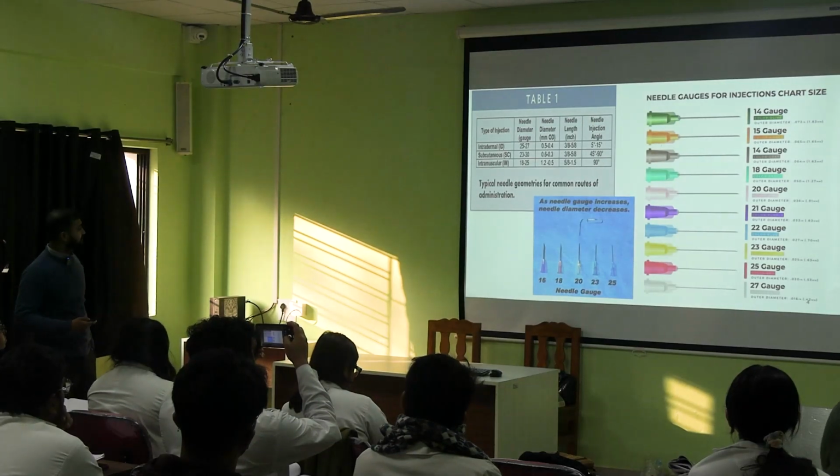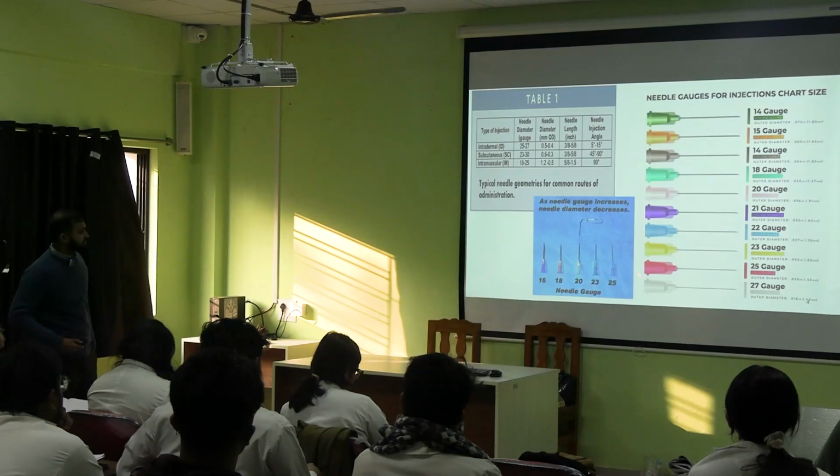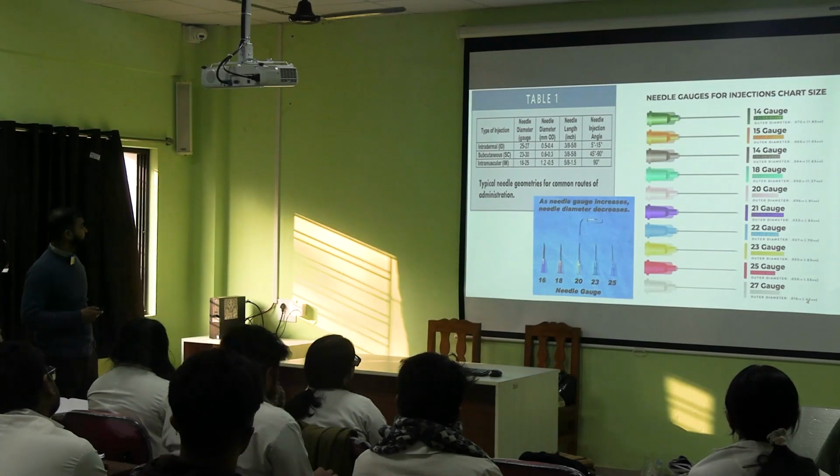So try to remember the gauge. Sometimes this color might be different according to the company, but the gauge remains the same.